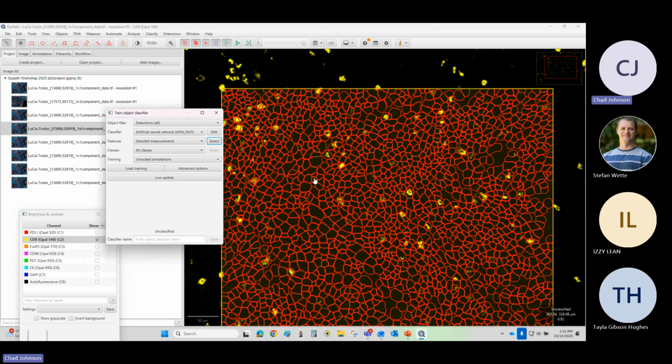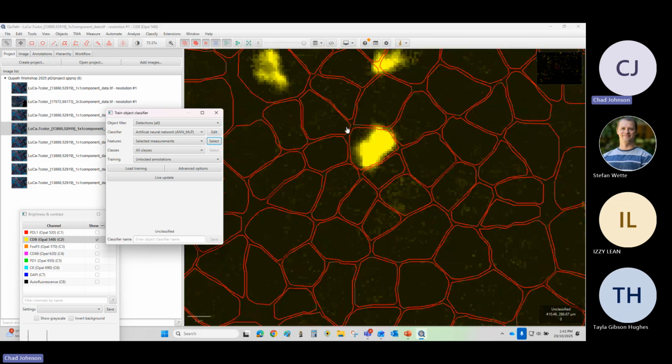So first of all, I'm going to come in here, and I'm going to use an ROI to start telling it what is and what isn't. And you can actually see there is some background here. So we want to make sure that it's not including the signal, which is basically it might be non-specific staining or autofluorescence, etc., etc.